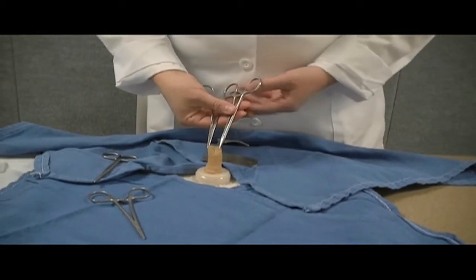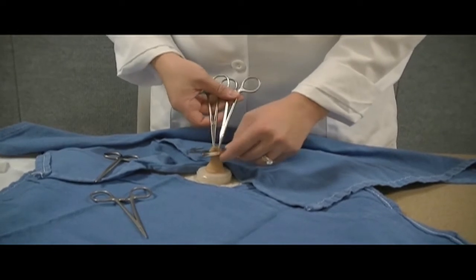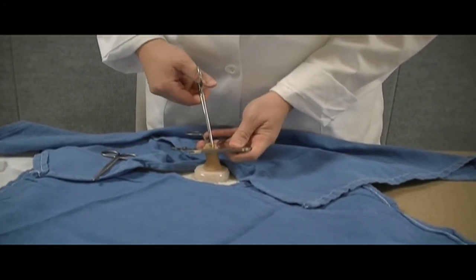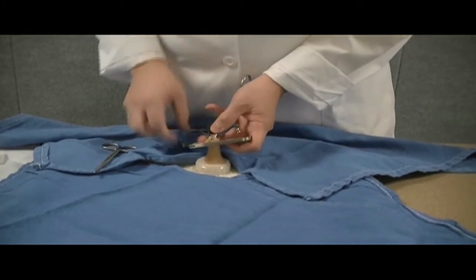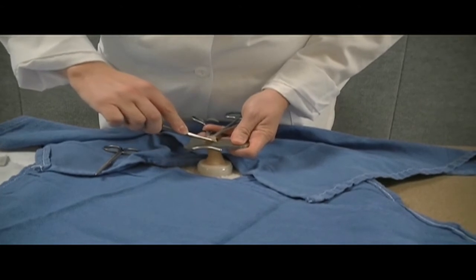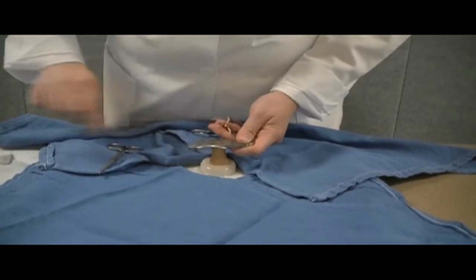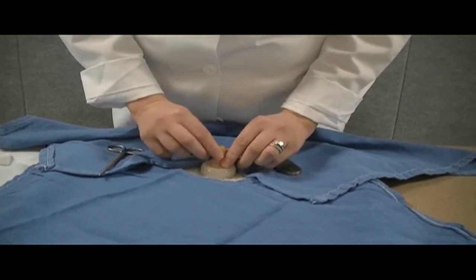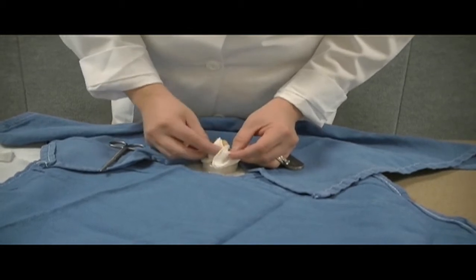We will now demonstrate the use of the Mogen clamp on this circumcision model. The Mogen clamp is then placed over the foreskin, leaving the hemostats in place, being sure that the apex of the incision is above the Mogen clamp. Another hemostat can then be used to be sure that the apex is above. Once the Mogen clamp is secured, a scalpel is then used to cut the simulated foreskin. The Mogen clamp can then be removed, and the adhesions formed from the Mogen clamp are then broken down, and just as you would in real life, the foreskin is inspected for completeness of the circumcision.